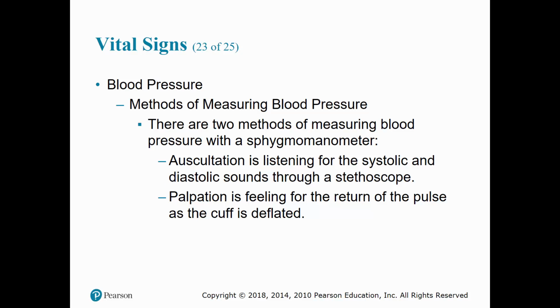When checking for a blood pressure, make sure that you don't keep it on too long, because this can cause issues in your patient. Also, make sure that you are supporting the arm and have the position in a relaxed position, because placing strain on the arm, or the patient placing strain on the arm, may change your blood pressure reading.